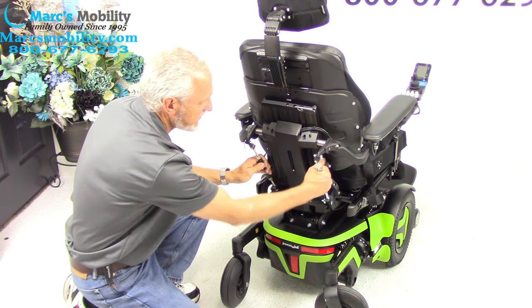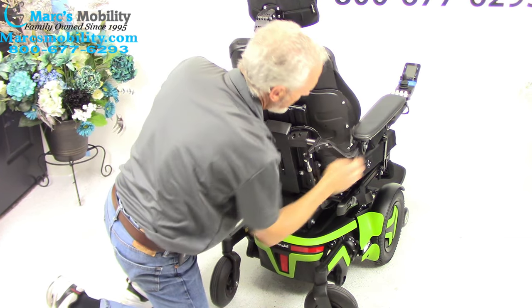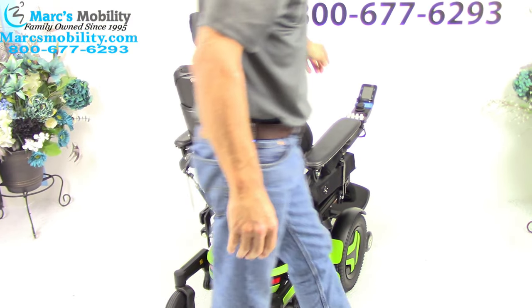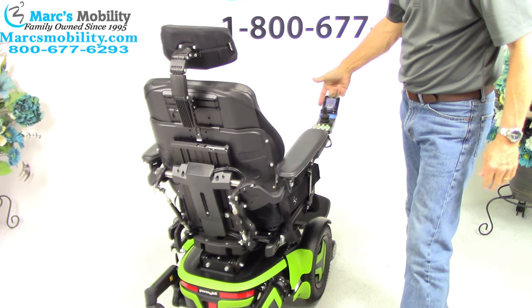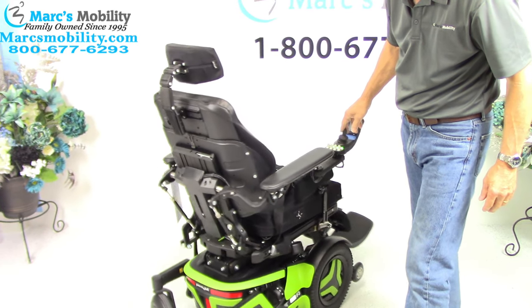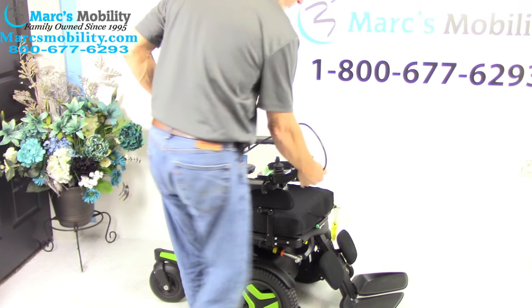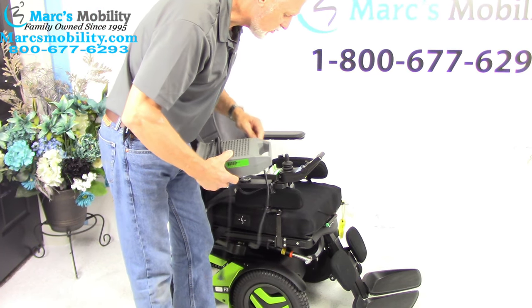These cylinders right here — if I turn these, it adjusts the tilt of the arm. So these arms can be adjusted to any position you want by turning these — it's easier if someone holds the arm up and then you twist it. When you charge this chair, you will take your Permobil charger and plug it right below the joystick. As soon as the light goes to full on your charger, the charger will stop charging.